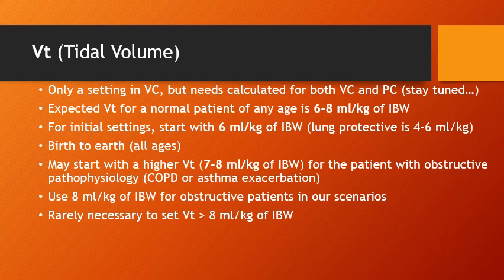That's on the high end of what we consider lung protective ventilation. And lung protective ventilation is what we're going to use for any patient who we suspect has any type of lung injury. So their lungs are already injured, damaged, stiff, non-compliant, whatever it may be. We don't want to make it any worse. And like we talked about earlier, we make it worse by causing too high of pressures in the lungs, barotrauma, like we mentioned earlier.